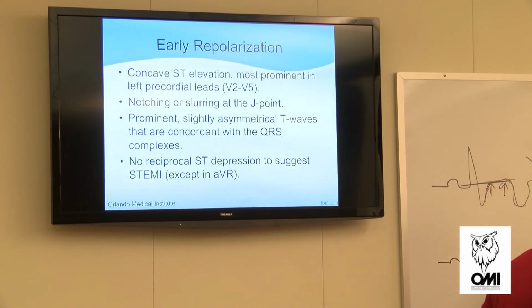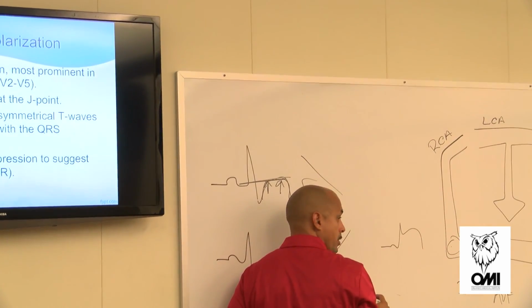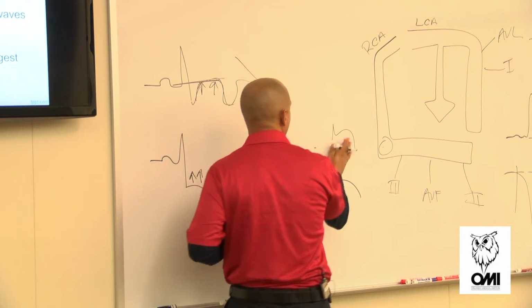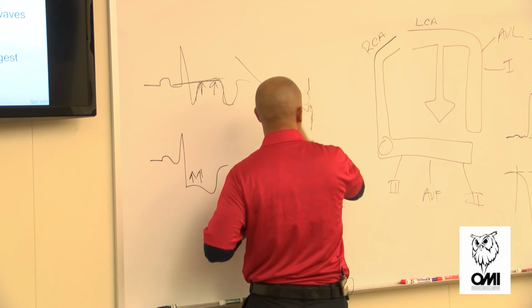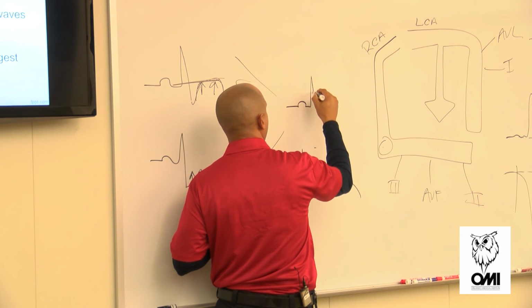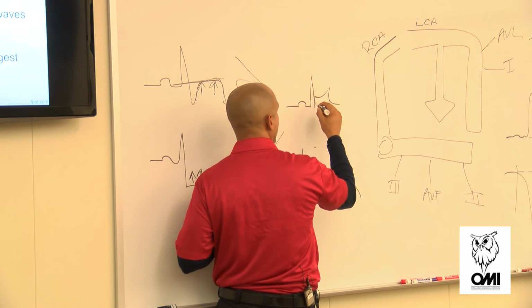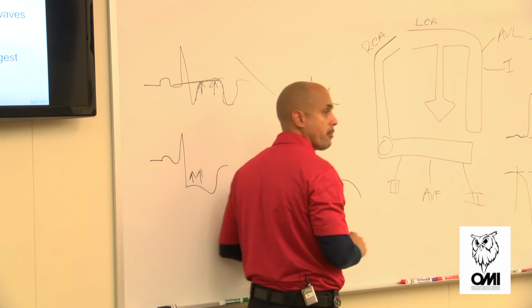Early repolarization means I fire depolarization of the atriums. Pause. I've depolarized the ventricles. Now, pause. Now they repolarize. Everybody with me? What early repo is, it should be repolarizing, but there should be a slight delay, then it repolarizes. So there's no delay. It goes right into repolarization. This slight pause doesn't happen. It goes right into the T wave, right off the S wave.